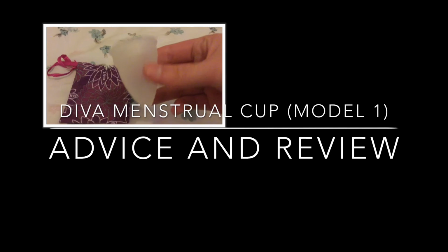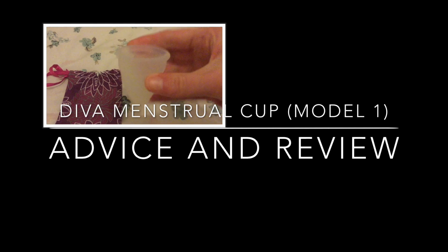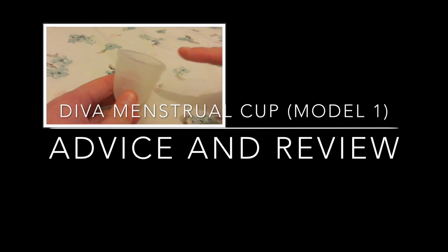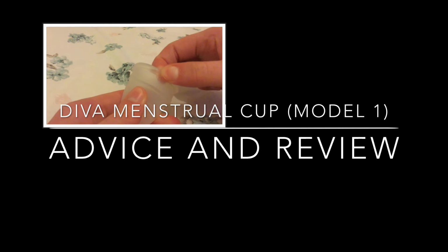Moving on to talking about the look and feel of the cup, it's very, very soft, as you can probably see, but one thing I found was that the top rim is quite hard compared to the rest of it, which, to be honest, I can completely understand why it's like that, but this sometimes makes it look and feel a little bit bulky. There are usually around 2 or 3 sizes to any brand of menstrual cup, so make sure that if you do want to purchase one, you get the right one for you. And of course, different brands offer different pros and cons, so look into many different brands and pick the one that you think will suit your lifestyle the best. Other than that, I think to many people it actually looks scarier than it is. Maybe scary is the wrong word, but hopefully you guys are understanding what I'm meaning.